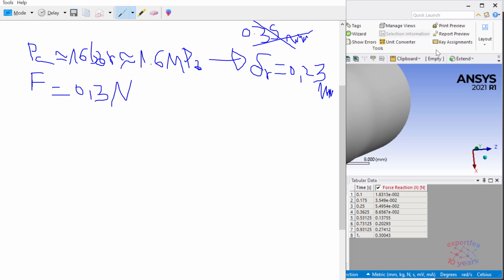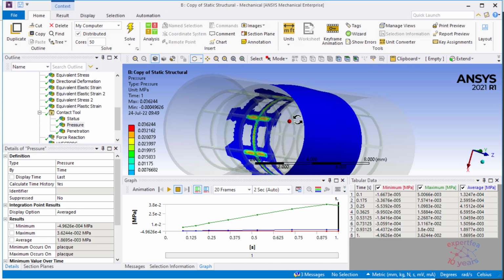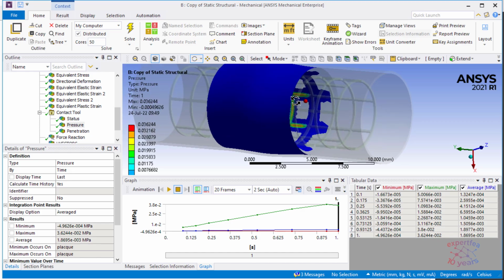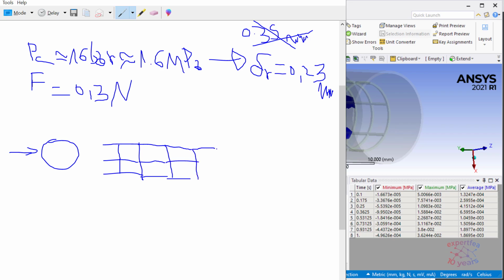Let's somehow calculate the real area in contact, let's say. So this portion, yes, strut with these other struts, they constitute a portion of the entire stent. So let's say if we have such instances in the entire stent, let me draw again. So the entire stent, seen from here, let's say, consists of such multiple instances. I'm drawing them separately in order to understand what occurs here.